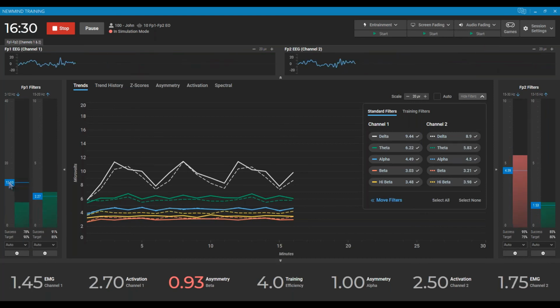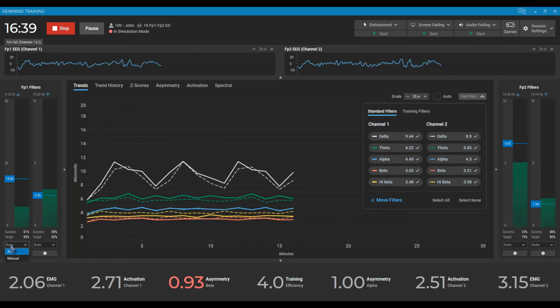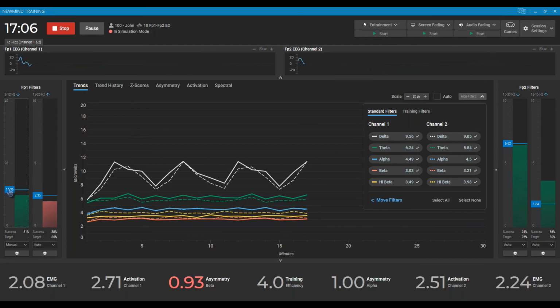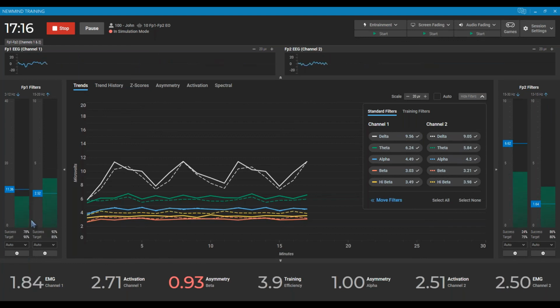It's just like if I were to go to a manual setting and bring the threshold down, let's say to just over 11 microvolts. In a matter of a couple minutes, as the software averages this out more, this success percentage is going to start plummeting, because we're not giving them the opportunity for this to move around. That's why it's generally not recommended to put them into a manual mode, because you tend to over-exhaust that brain, making it work harder than it really should. You're going to be consuming a lot of resources trying to do that.